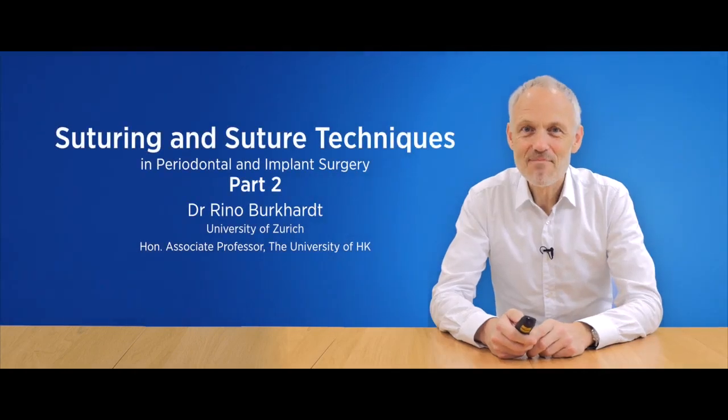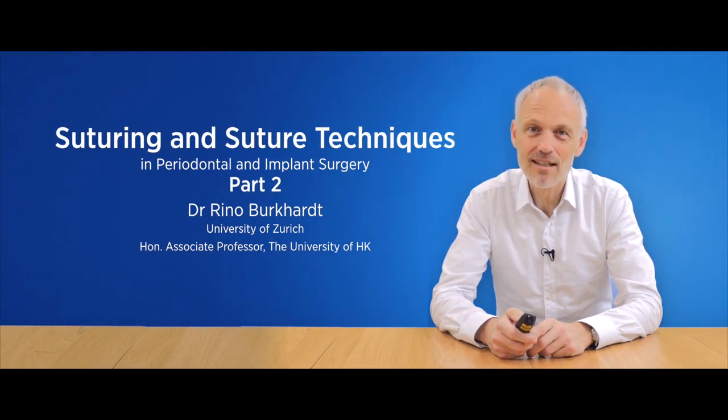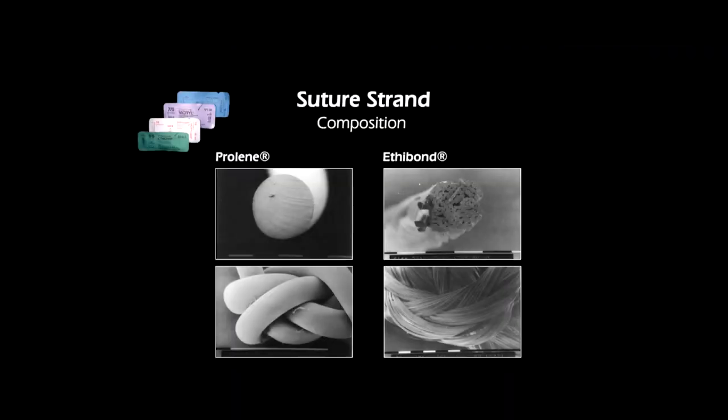So dear friends, in the following seminar we will talk about suturing and suture techniques in periodontal and implant surgery. One of the problems in suturing is the trauma. Suturing always is a trauma. So in the first 24 hours the mechanical trauma will be the main trauma, while in the following wound healing period trauma by bacteria will increase.